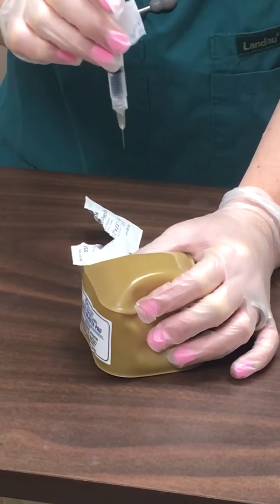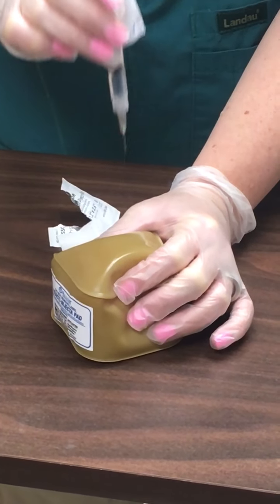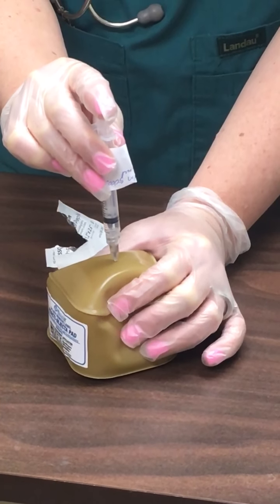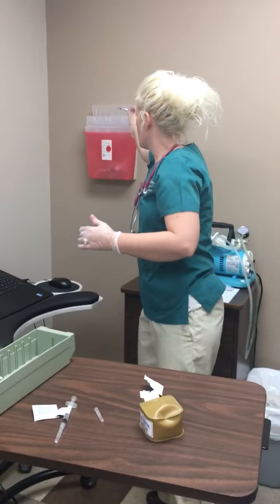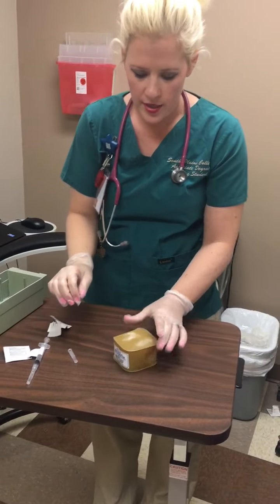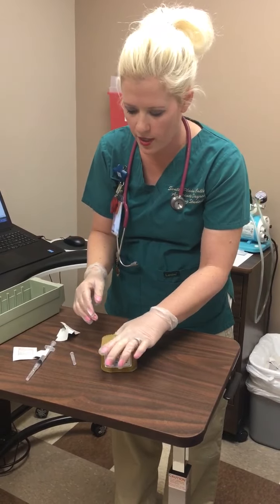I'm going in at a 90 degree. I'm pinching 1, 2, 3, and poke. And I'm sticking in, pushing the medication in, making sure I'm pinching the whole entire time. And then I'm going to let go and immediately go to the sharps. Okay? How was that? Was it okay? A little bit of a pinch. I'm very sorry about that.